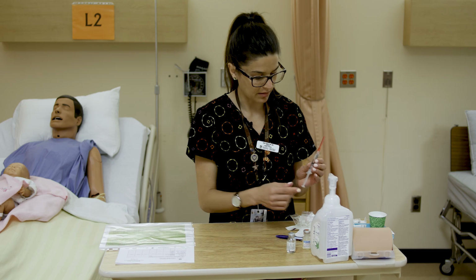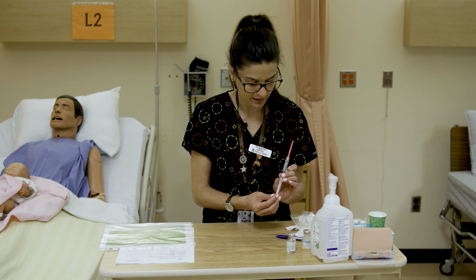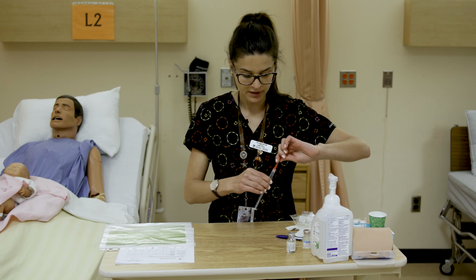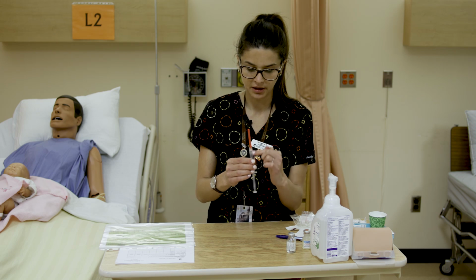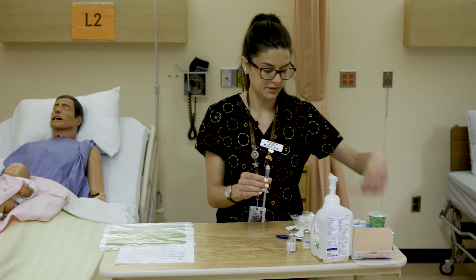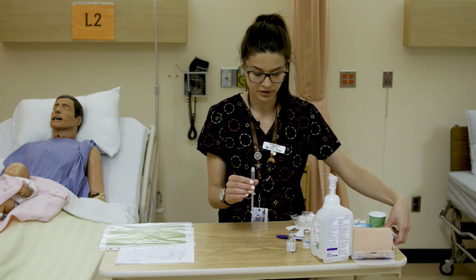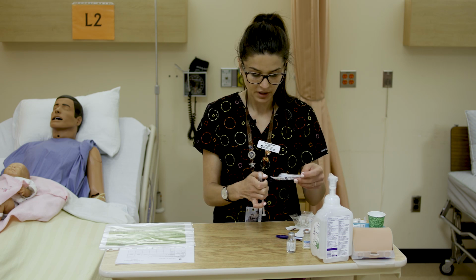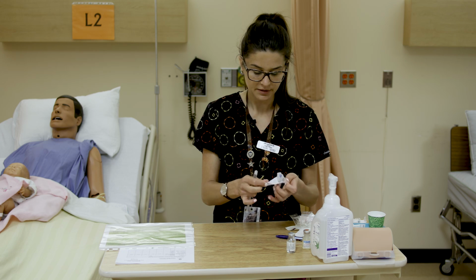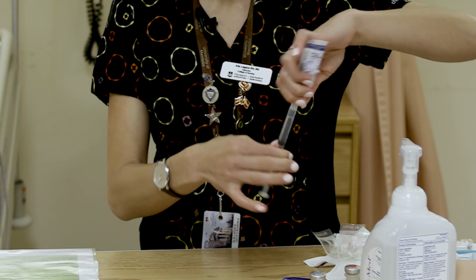And then again, similar to with subcut and intradermal, we're going to pull back before we change over our blunt fill, so that all the medication is in the barrel of the syringe and not in your blunt fill needle that will ultimately go into the sharps. And now we're going to want to get our needle for injection. So I will attach that in a similar fashion as the others, and then we'll review why this needle.